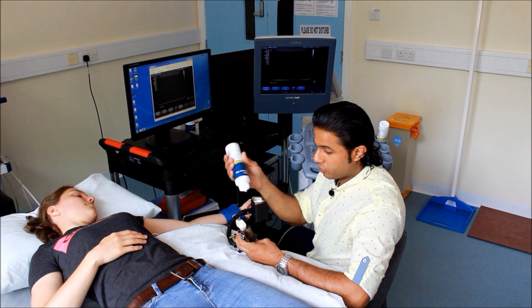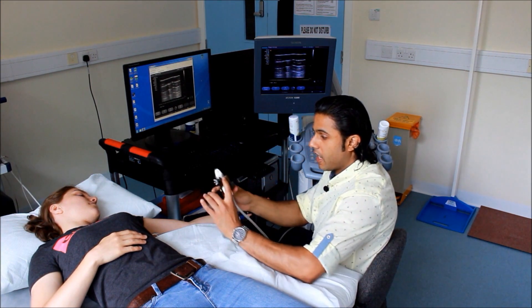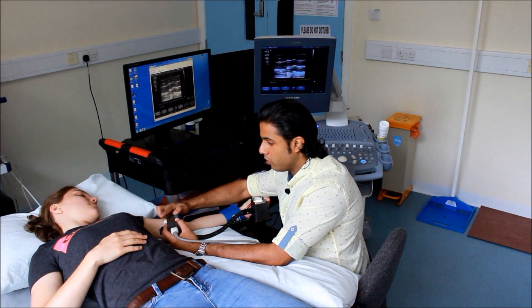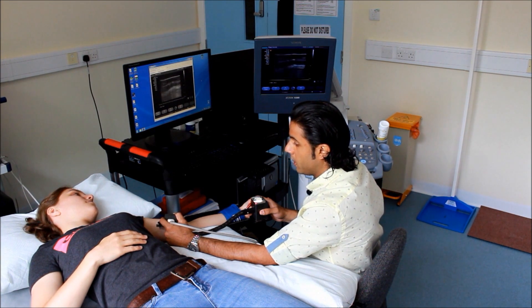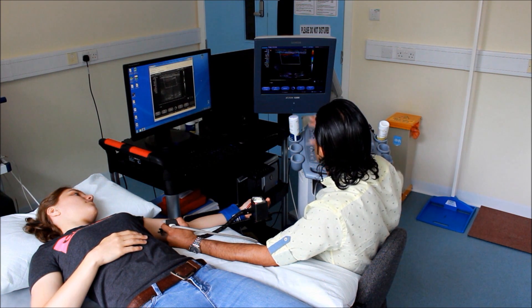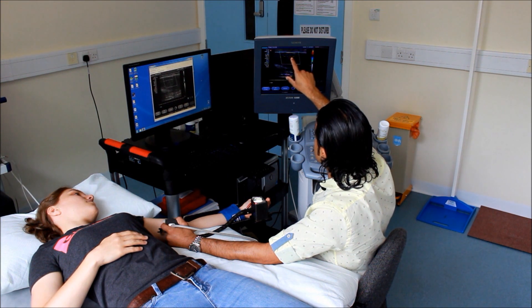The first thing we actually need to do is make sure that we get some ultrasound gel onto the probe. I always liken this to putting some toothpaste onto a toothbrush — put it on nice and neatly. Now we're going to scan for the brachial artery, which is going to be somewhere in this region of the arm. The best way to find it is to start from the top and hold the probe level with the top of the bicep, then scan down. We can use colour Doppler to ensure we have the artery in sight. If we had a vein, as we compress the probe into the arm the vein would disappear. With the artery you carry on getting this pulsing that we can see here — so this is the brachial artery.